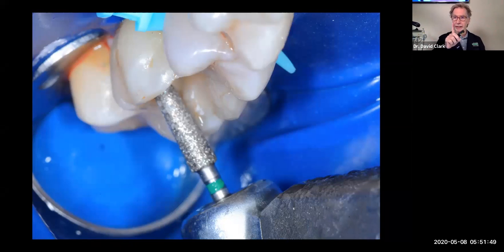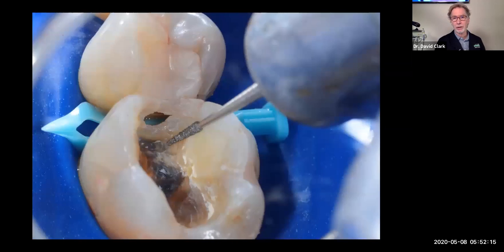Instead of taking the burr in this way, we take the burr laterally. So now we're going to begin to do a calla lily while we're removing the composite. We don't just cut a Grand Canyon in the tooth anymore. The burr comes in at 45 degrees. That's a massive change. Taking the burr from here to here is like reinventing the world because we've been taking burrs in teeth like this for 200 years. So when I'm removing decay now, we take the burr laterally like this. We don't break the cavity wall anymore with a big burr.